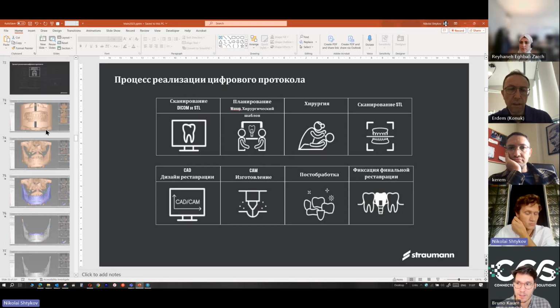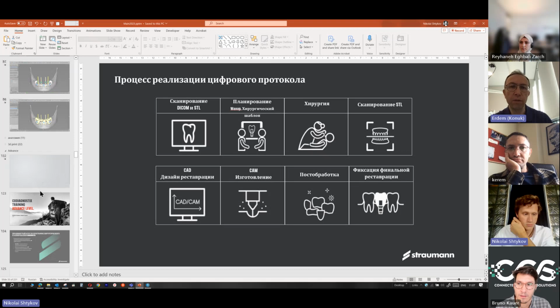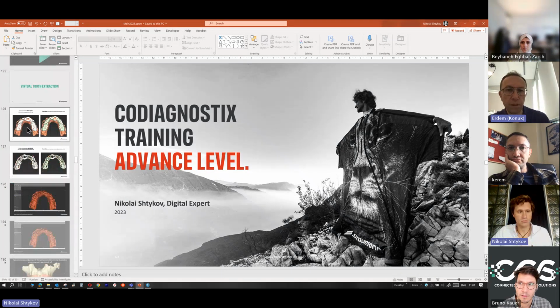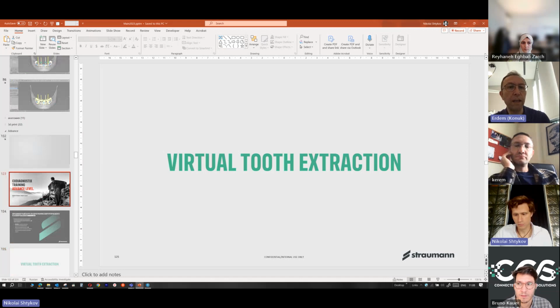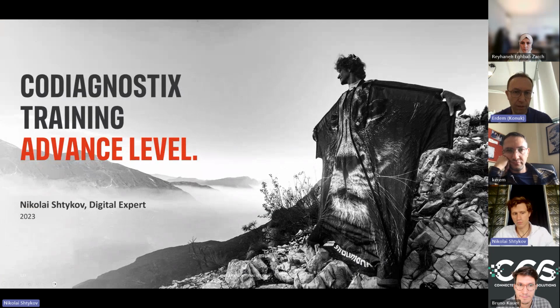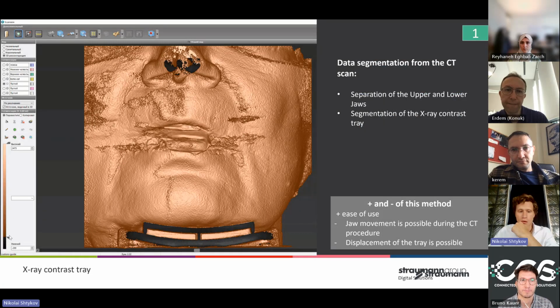Some of them are outsourced, especially we are always working with Gökhan for the CoDiagnostiX part. We are taking the service, let's say outsourced, because Gökhan is also experienced in CoDiagnostiX. We have really good experience in digital workflow and guides, by the way, and we have a full digital workflow in our clinic. After Gökhan designs the guide with us in these online meetings, we produce it in our clinic. Okay.